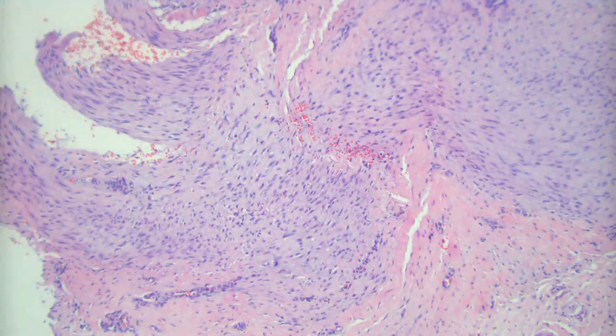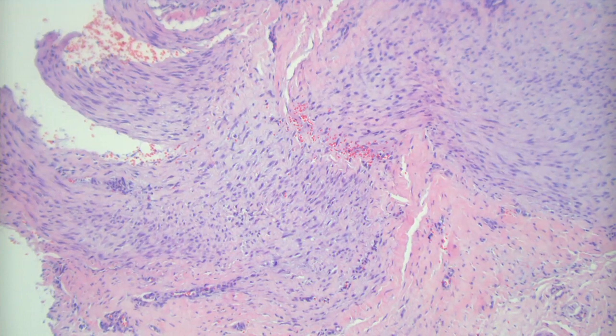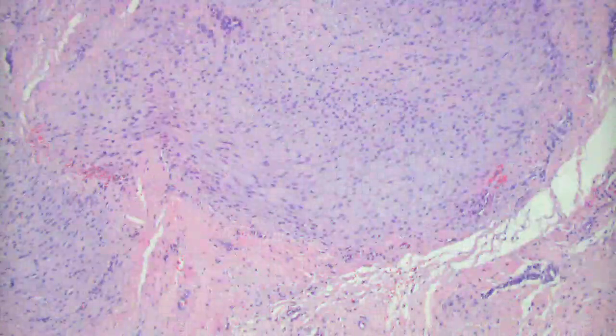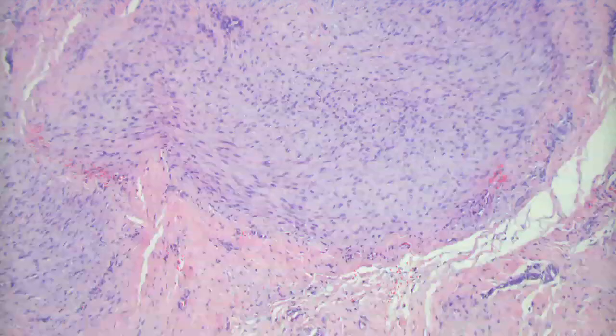What kind of fibroma specifically? This is deep, right? So maybe like fibroma of tendon sheath. So there's a family of entities called the fibromatoses, right? Yes. So this could be one of those. So nodular fasciitis, if you leave it alone long enough, might eventually turn into a fibroma, maybe a fibroma of tendon sheath. Giant cell tumor of tendon sheath is in that category. What else is in the family of the fibromatoses?